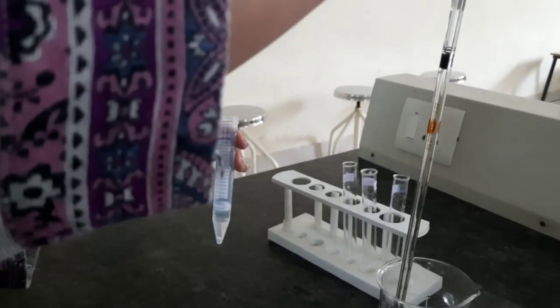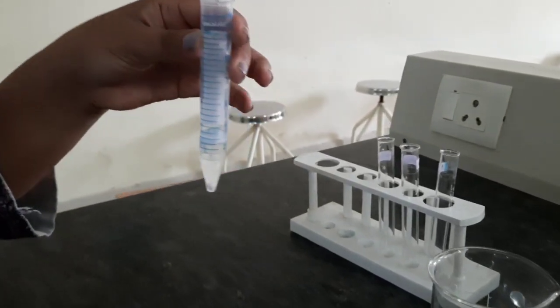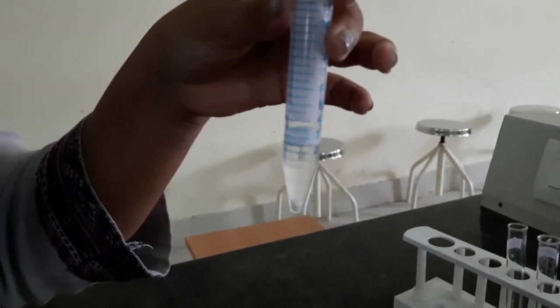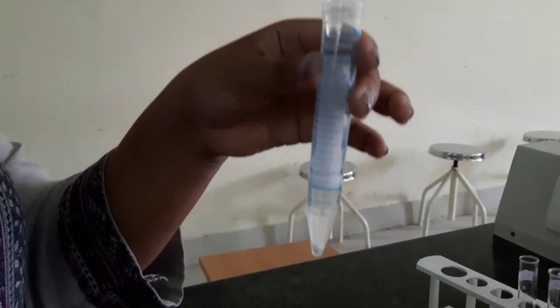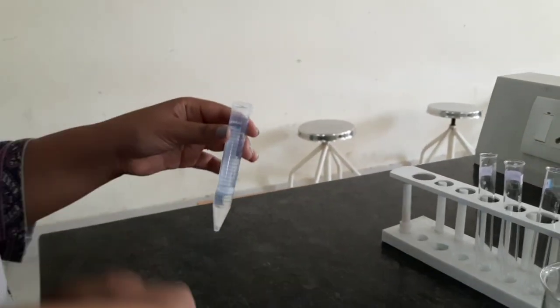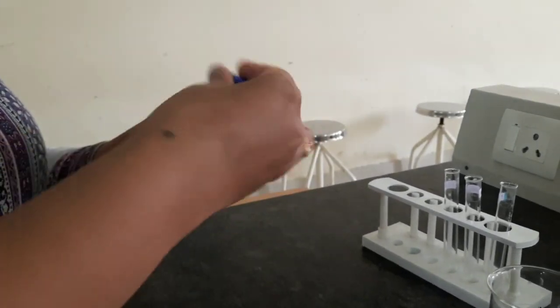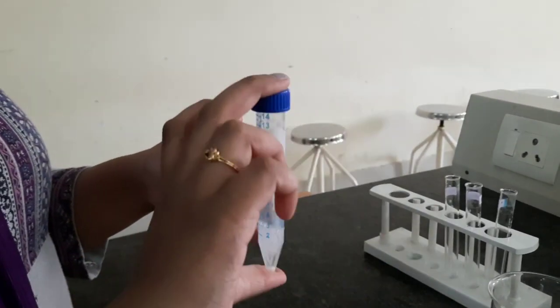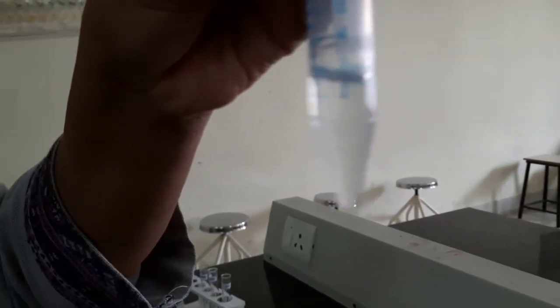We have to mix it thoroughly for dissolving it completely. So let us mix it now. After dissolving, you can see that the pellet is completely dissolved.